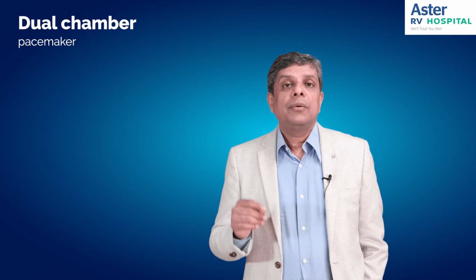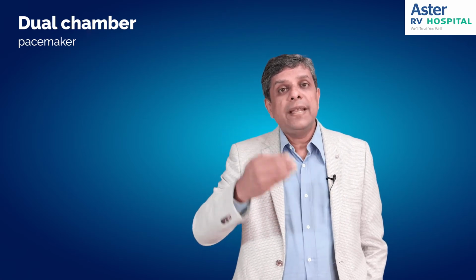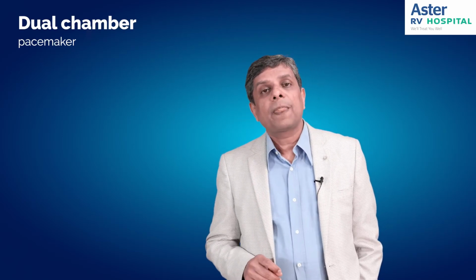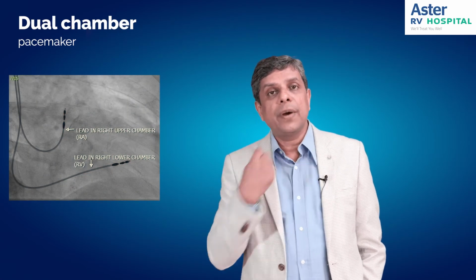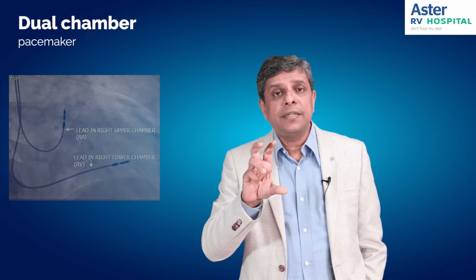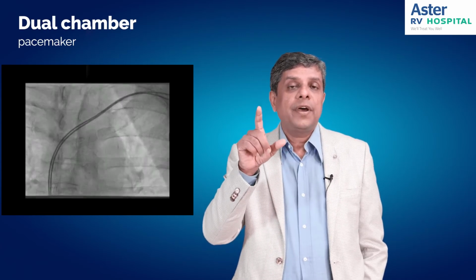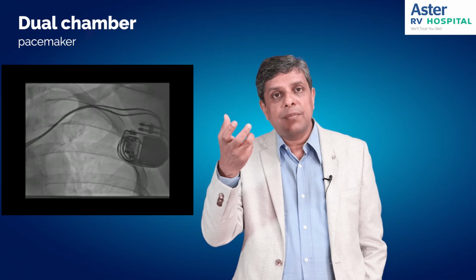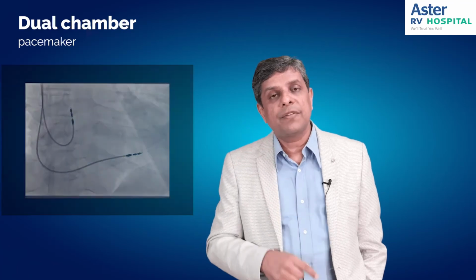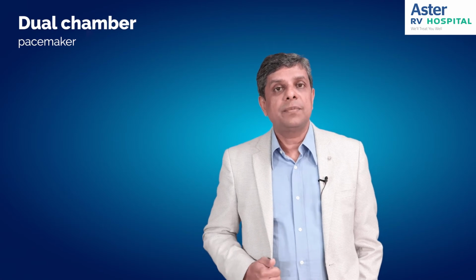There are times when we have to be sure that both the upper chamber as well as the lower chamber work in tandem. The upper chamber pumps, then the lower chamber pumps. So for both of these to be synchronized properly, we need a dual chamber pacemaker. A dual chamber pacemaker has two wires. One wire goes into the upper chamber, the other wire goes into the lower chamber. Now the wires detect if the electrical current is flowing properly or not. If there is a problem, the upper wire fires the upper chamber, and the lower wire fires the lower chamber. So both the chambers, the atria and the ventricle of the heart, work in tandem so that the patient's heart works in a synchronized manner.